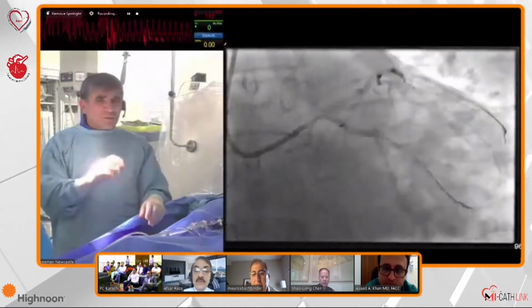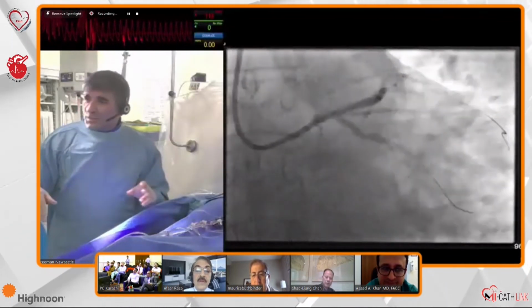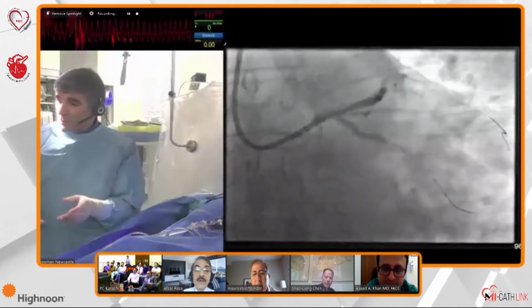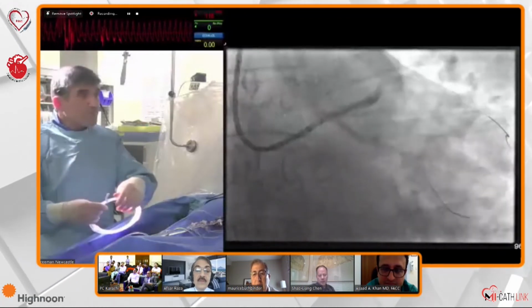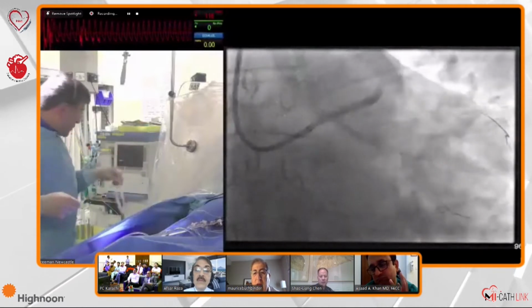Yeah, I'm just going to go in the ostium. I won't go too crazy with the pressure. I think this is a 3.5. When we IVUS it, it's going to look bigger than 3.0, because you judge that from the size of the left main, to be honest. The left main is huge.